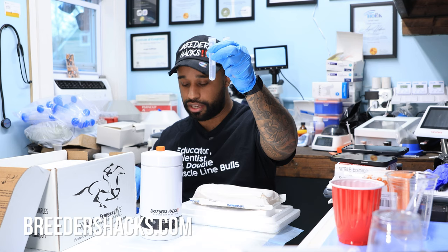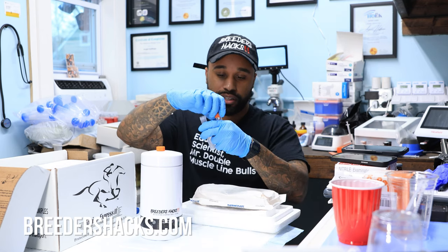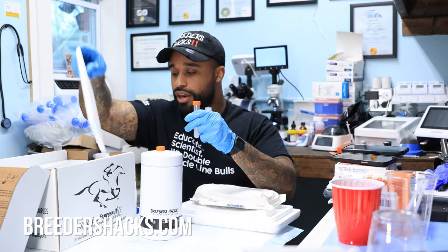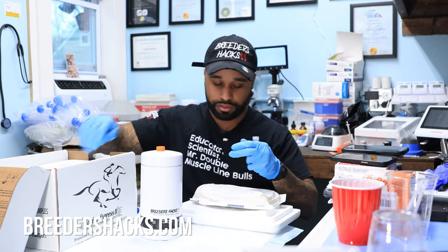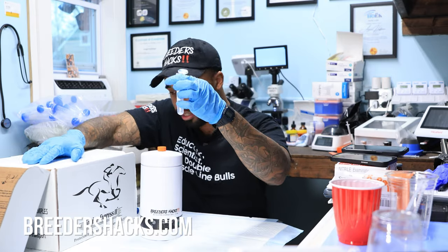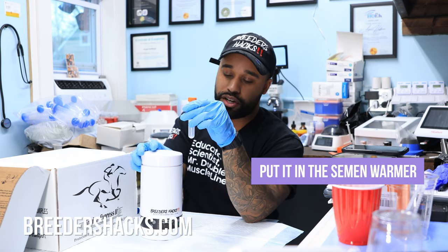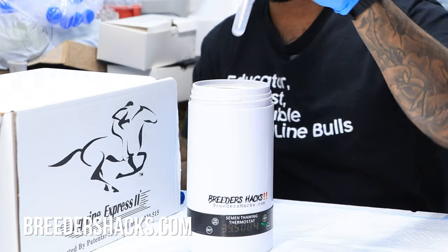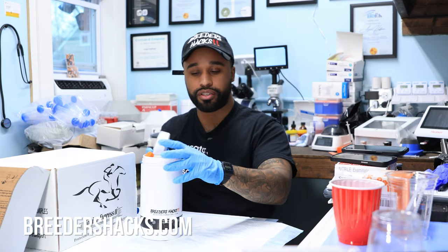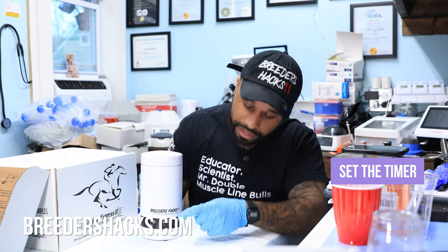All we took was literally a drop. I cap the original collection and put it back in the box. Then the small eyedropper amount we took — we go ahead and place that in the semen warmer. Pop the top off, pop it inside — there's water in there as we saw earlier — and close the top. Then I set the timer.